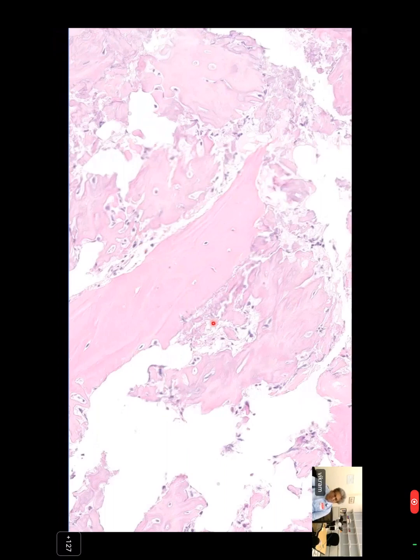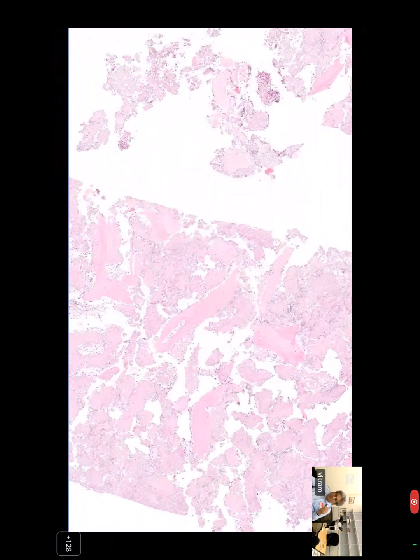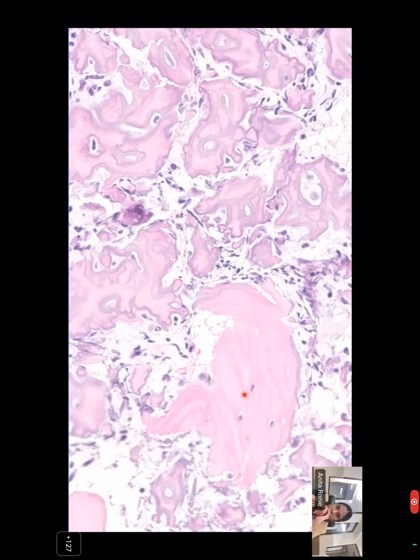This is the tumor. This stuff is infiltrating native bone. Remember when we talked on Tuesday, we talked about a biopsy causing an artifactual pattern of infiltration. This is true infiltration because you can see this neoplastic bone is stuck on this side, and this neoplastic bone is stuck on this side. So essentially you have neoplastic bone on three sides of normal bony trabeculae. And I know it's normal bone because it's lamellar, right? This is infiltration. So even though this tumor is very, very well differentiated and looks very, very low grade, it is an osteosarcoma.